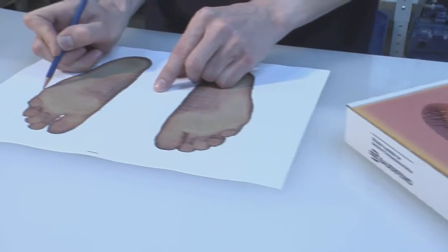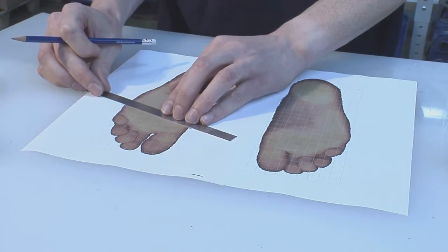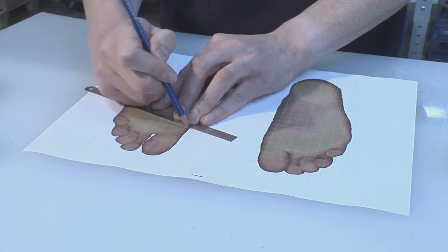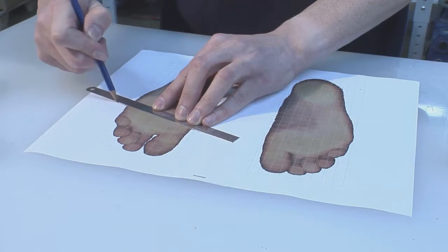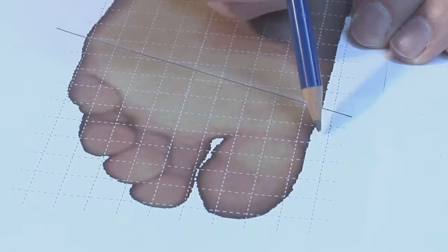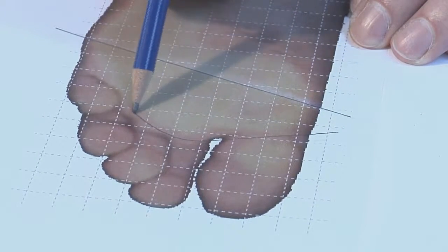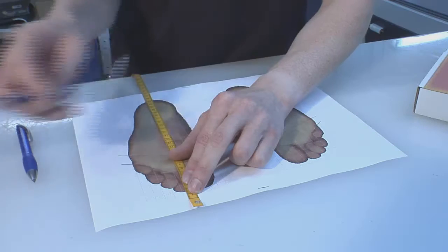We recommend marking the ball line that goes through the middle of both MTP joint 1 and 5. You'll need that line to select the correct orthotic size in order to properly fit the orthosis to the individual's foot. Additionally, the toe area gets marked as the thickness of the insert will later be reduced there.